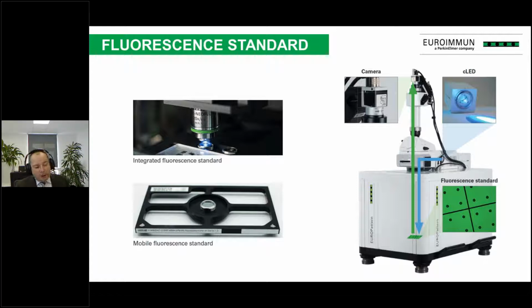Some older devices don't have this fluorescence standard inside the microscope. For these devices, you can also use a mobile fluorescence standard, like here in the image.